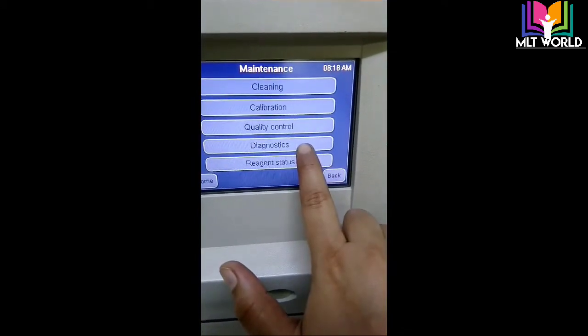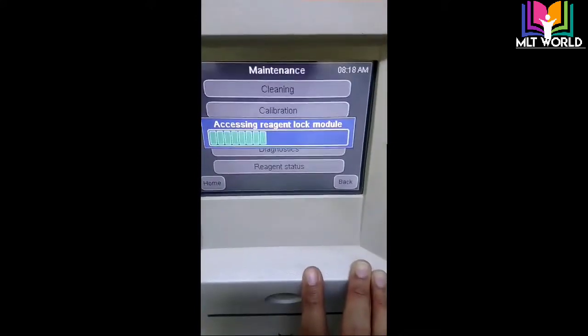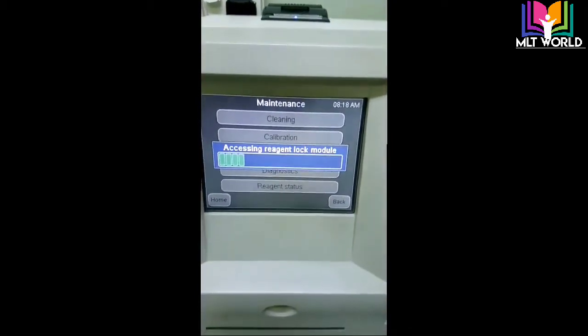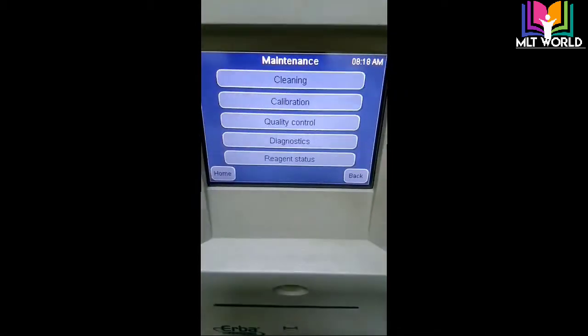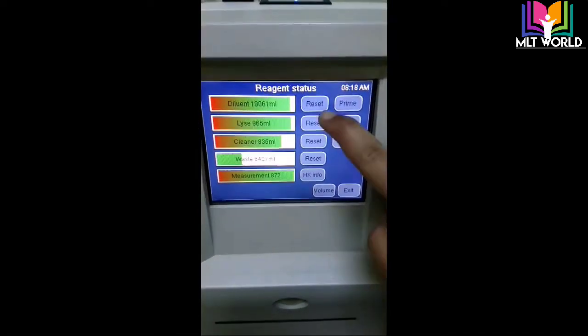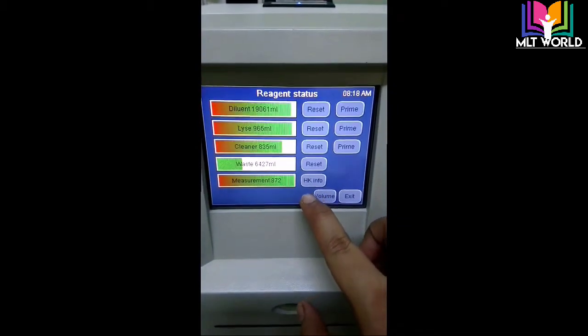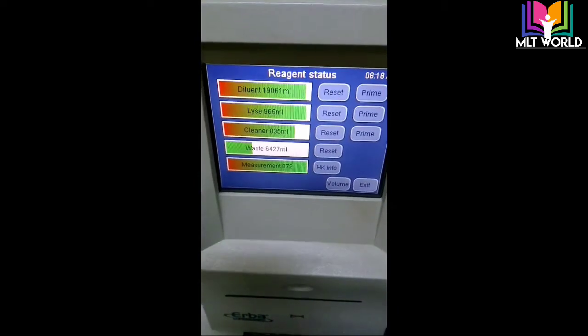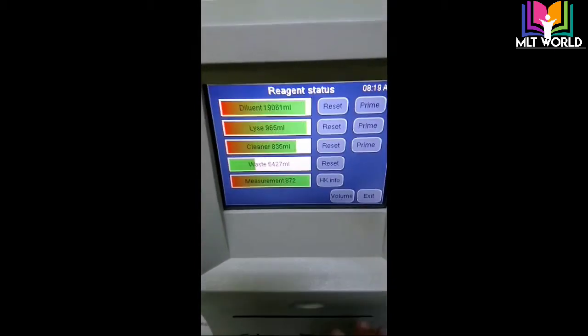Diagnostics are also handled by the engineer. For reagent status, we check daily, or when an error occurs, we check the reagents at that time. You can see the diluent level, lyse level, cleaner level, and waste level. For measurement, there is a chip that comes with the lyse bottle — this chip is pre-loaded for 1000 tests. After 1000 tests are completed, we change the chip to run further tests.